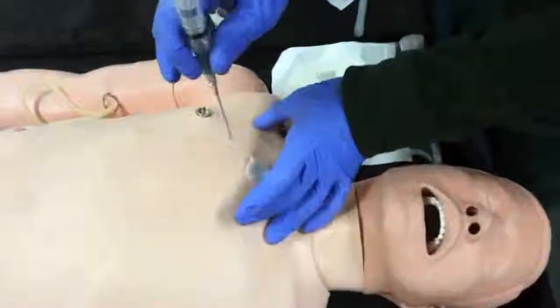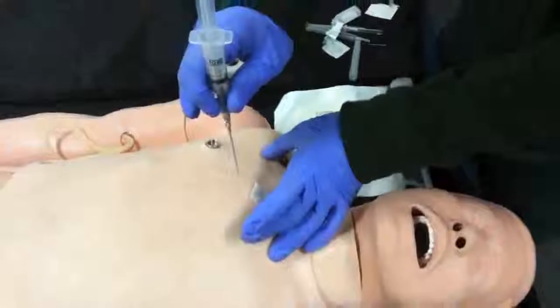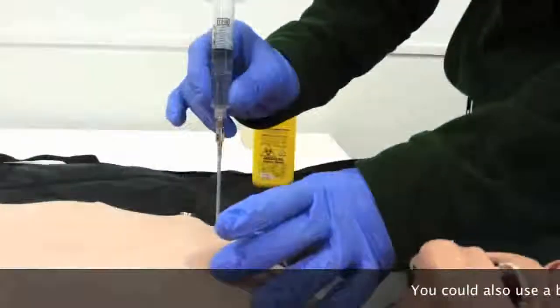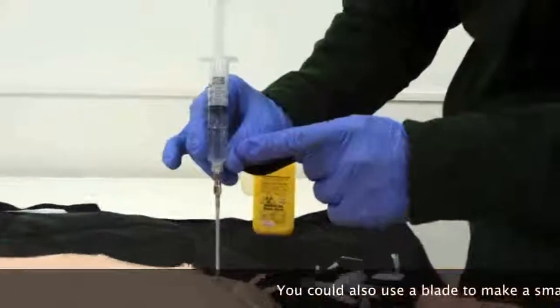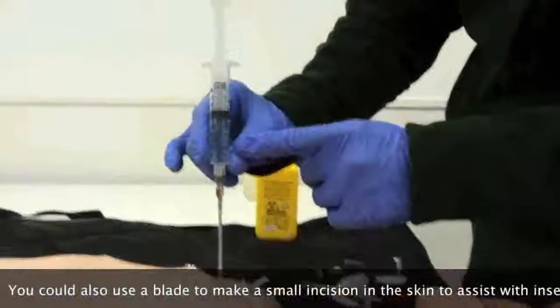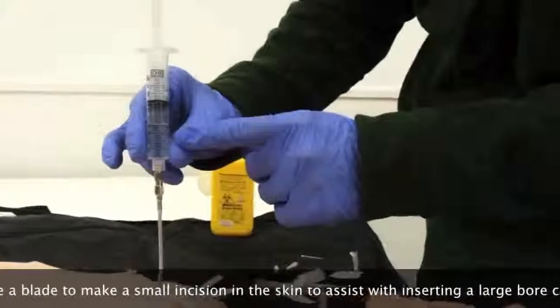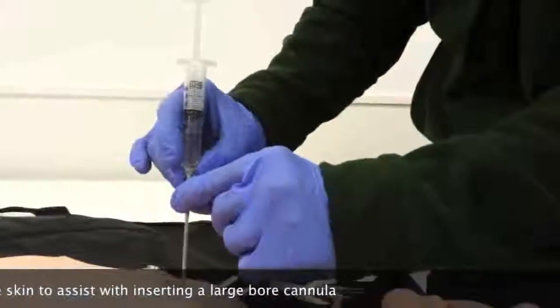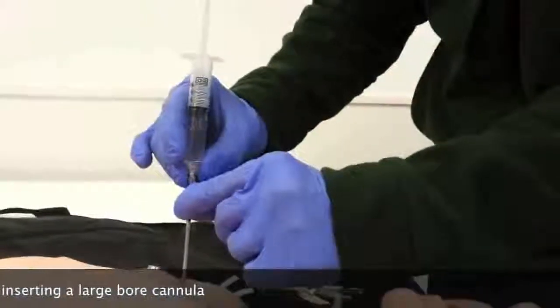Perpendicular to the skin, angling in towards the vertebral column, advance the needle in, and what you should notice is that you get some bubbles in the chamber there. So you know that you've got a tension and it is in the right spot. What we can do now is advance slightly and then advance the Teflon.